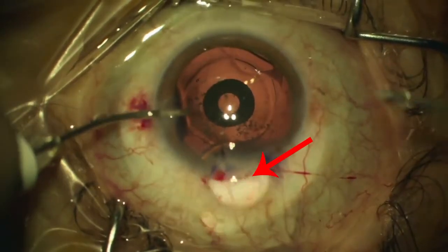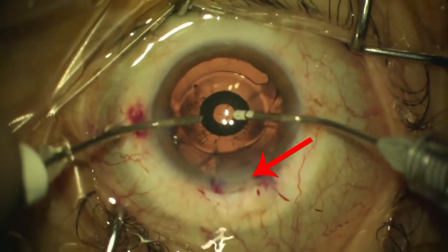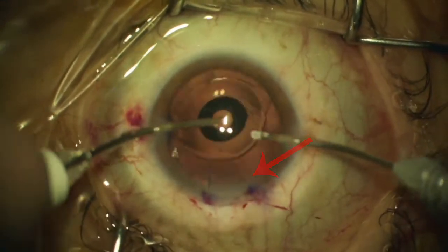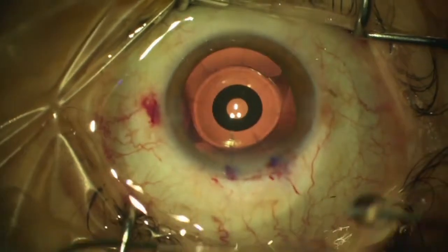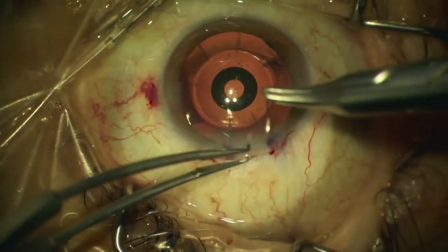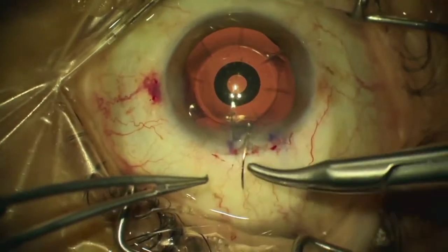Just when the I/A tips are introduced for cleaning up the OVD, the problem becomes obvious: one of the RK incisions has perforated and we have a completely new situation. The accidentally enlarged wound needs to be closed immediately. The sutures must be tight without inducing too much astigmatism.